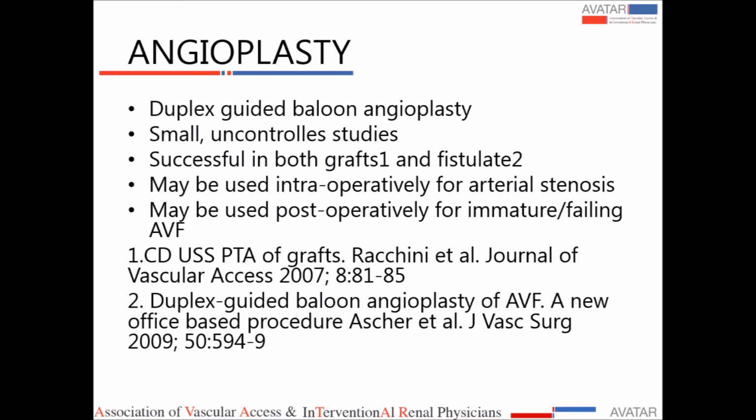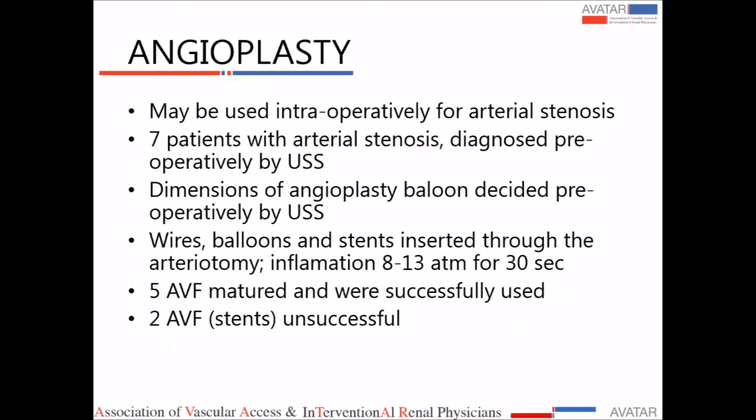And then what's the point of doing all this if ultimately you're still going to have to give the patient contrast or radiation, if you're going to have to do your angioplasty under fluoroscopy? So there have been a couple of centers that have started doing angioplasties under ultrasound guidance. We are not one of them yet. But these are small, uncontrolled studies, and it has been successful in both grafts and fistulas. Patients have been done intraoperatively for AV fistulas, as well as office-based procedures.